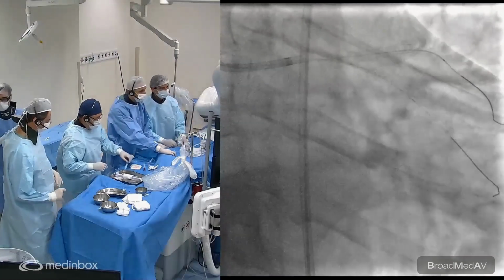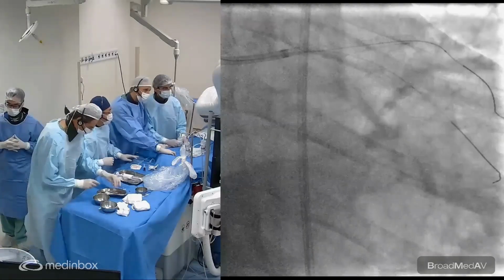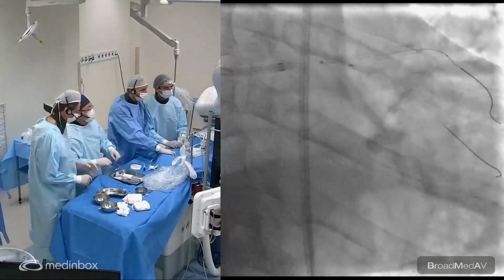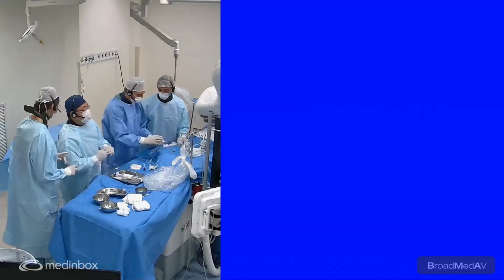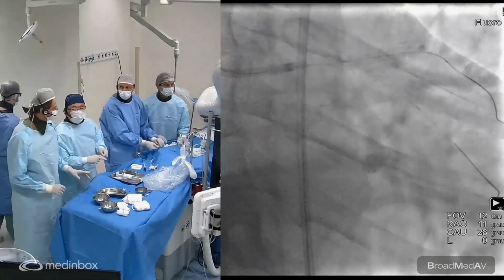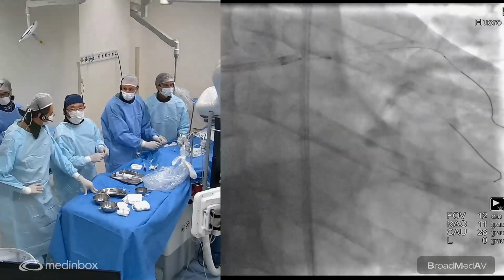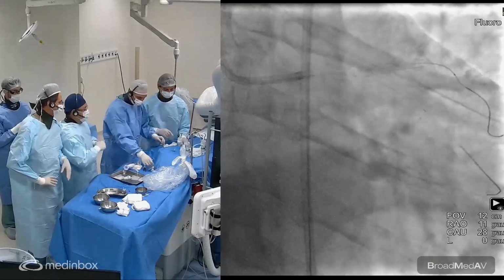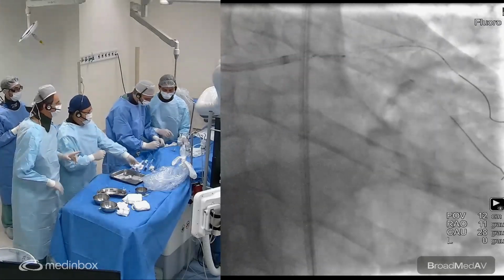Okay. We have all of them in place, and then you can do one side. Where is the 3.25? Easy to cross. You see, Fausto, even without opening the cells, the 3.0 balloon went very easily into the circumflex. Again, this is a good effect of the POT. So this is a 3.0 balloon. Yes, 3.0 by 8.